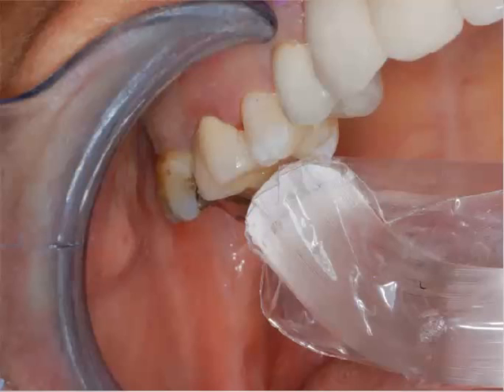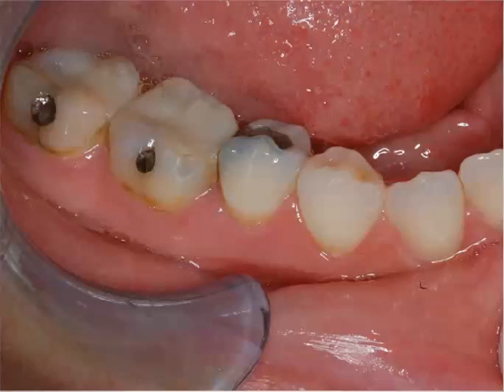The reason why we light cure it with our LED, which has about 1,200 milliwatts of energy, you'll probably get another maybe up to 10% conversion of that polymer, the cement polymer, a little stronger polymer form when we can introduce the light into that. And anytime I have an all-ceramic restoration, I'll do that time and time again, whether it be zirconia, pressed ceramics, and you get a really good hard firm set right away, not having to wait for the cold cure to go through the typical polymer formation phase.